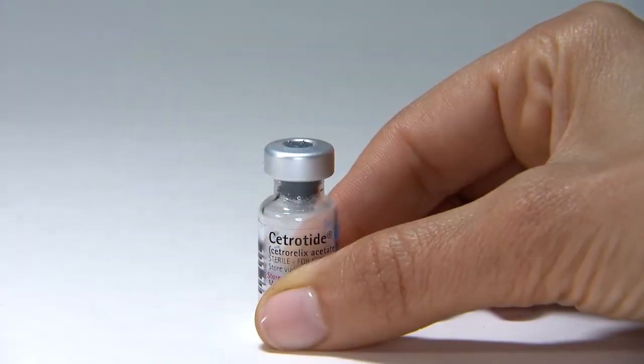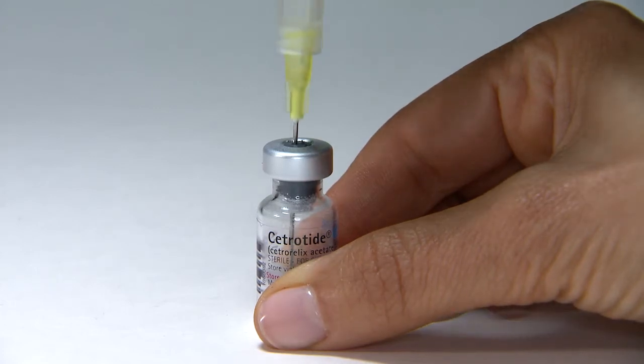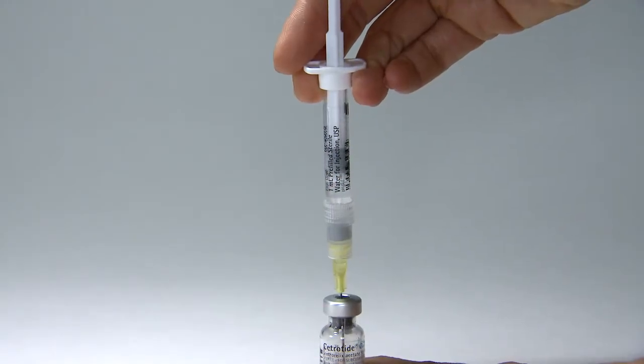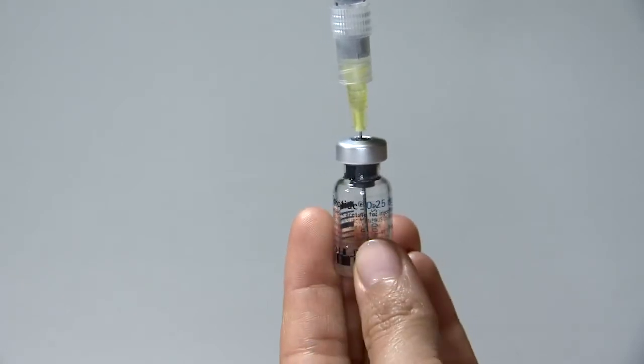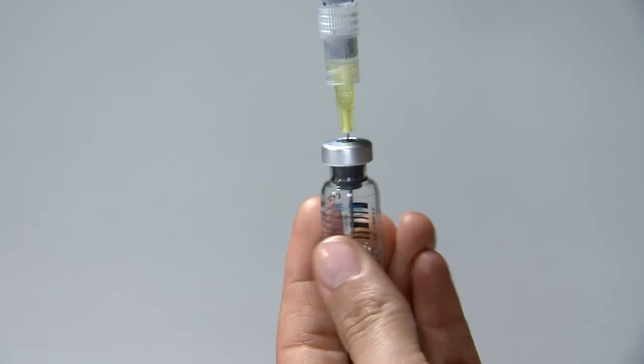With the vial on a flat surface, insert the needle of the pre-filled syringe straight down through the marked center circle of the rubber stopper of the vial. Slowly inject the water into the powder vial by pressing on the plunger. Swirl the vial gently. If bubbles appear, wait a few moments for the bubbles to settle. The liquid should be clear.